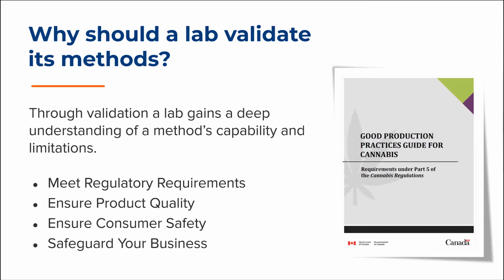Method validation also provides vital information to assist in laboratory investigations by identifying the operating conditions under which the analytical method can reliably be run. Let's unpack that last statement.